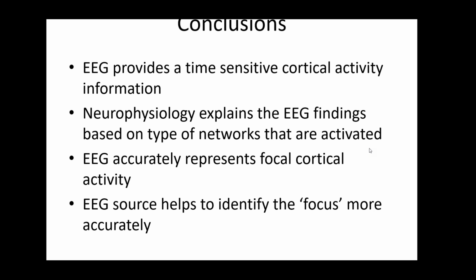Okay. This question comes from Dr. Ran Paria from University at Buffalo. Excellent presentation. I would like to know, when you source localize sLORETA from scalp EEG, do you use specific parameters in Curry?